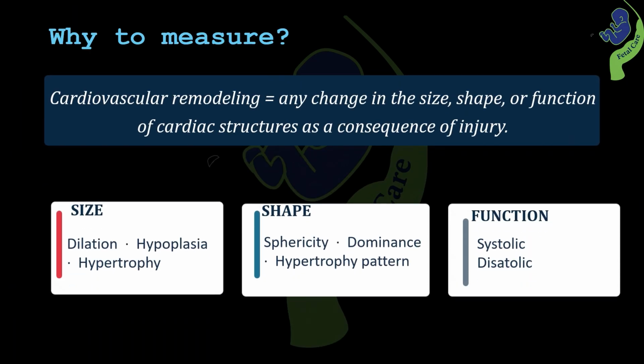Now let us see, why do we need to measure the various structures in fetal heart? This is because in case of any injury, the heart undergoes change in size, shape or function, which is also known as cardiovascular remodeling.